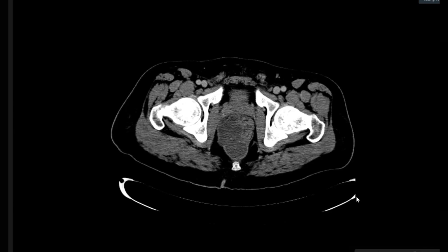So I will start by describing the abnormality, then I will put the summary: I'm dealing with a perirectal or rectal lesion. So my differential diagnosis is so and so and so. You have to tell the examiner you know everything about the differential, you know everything about the case, so you will guide them to the proper treatment or final diagnosis for this patient.